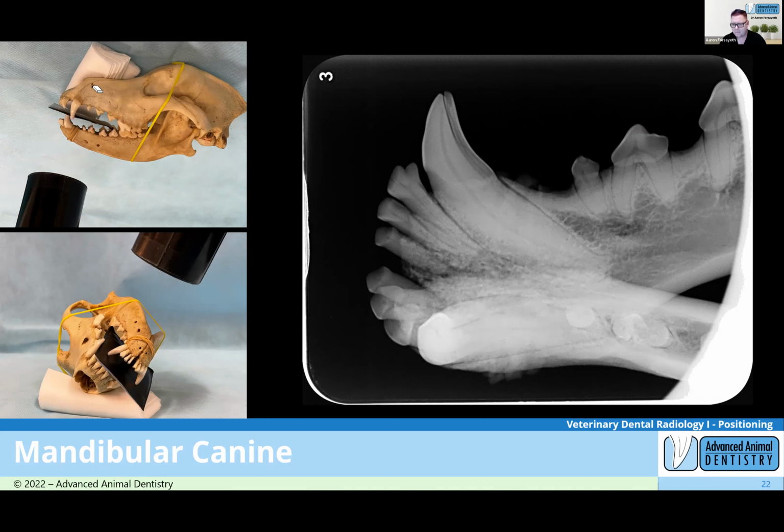I've not had the opportunity to use those plastic guards, Karen. I know what you're talking about, but as I said, I've never even used them. I don't think we've got too much damage to our plates. The last one we used has a little bit of damage on it. That plate's 2 years old.